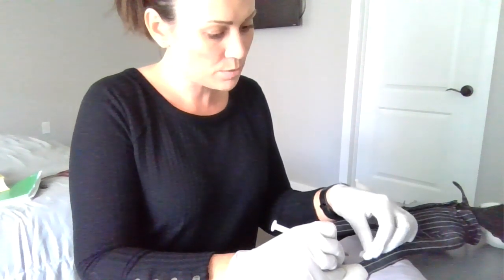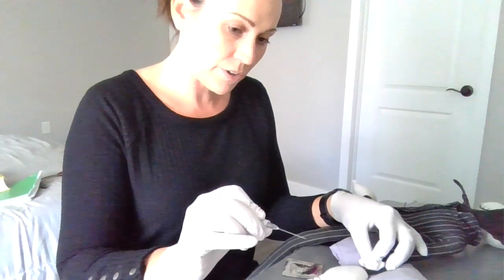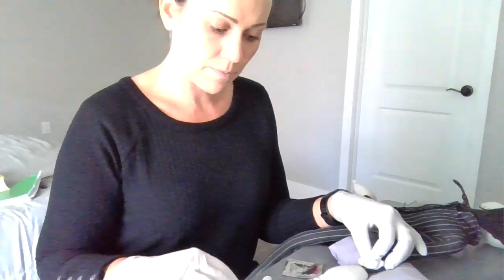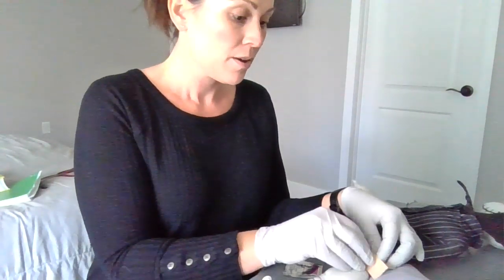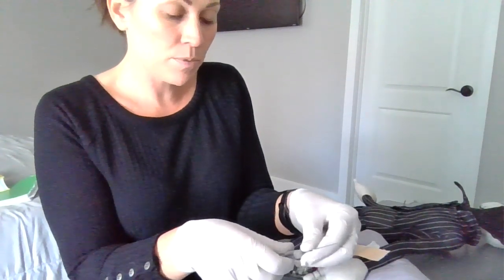I'll go ahead and get my gauze once it's all filled, and I'm going to hold and apply pressure, keeping that needle facing away from me. I'll go ahead and cork it using whatever safety system that you have for the syringe. I'm going to hold this pressure for about three to five minutes, then get my band-aid and put the bandage on there.